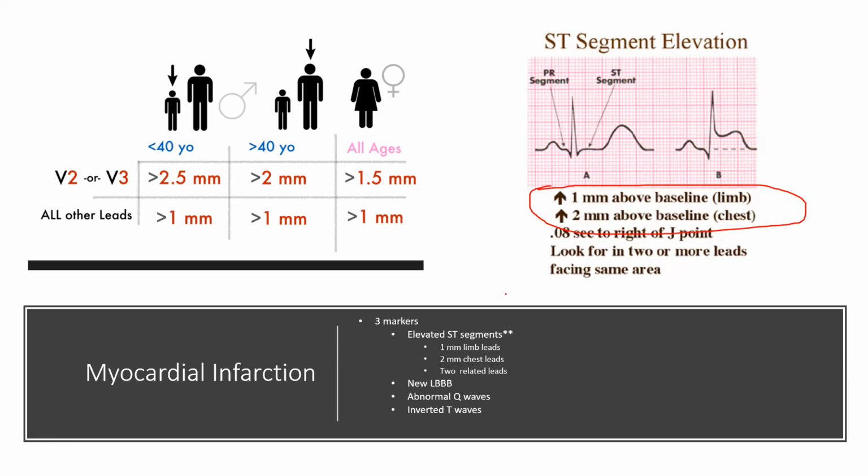Now, in this class, we will use this criteria, being aware that some cardiologists may use a different criteria, but in diagnosing STEMI in a quick manner, we are going to utilize this particular criteria. Okay?